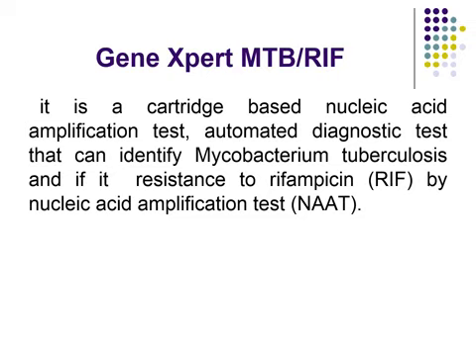This test called GeneXpert diagnoses tuberculosis, and at the same time it is a rapid antibiotic sensitivity test.